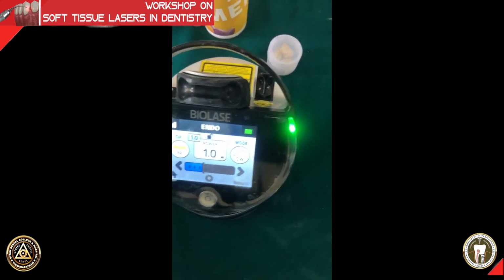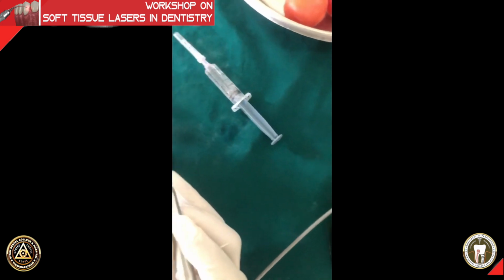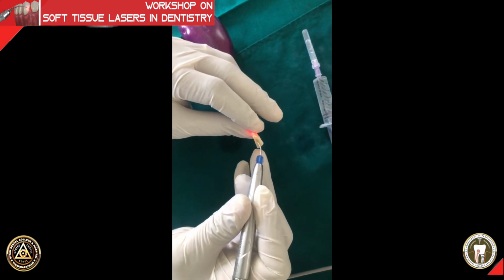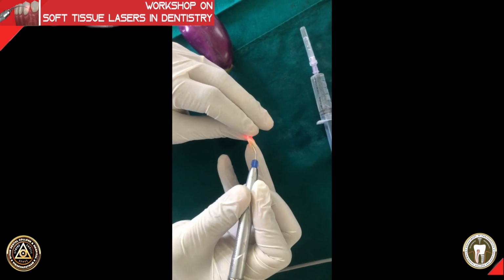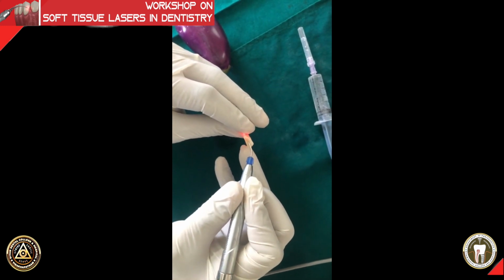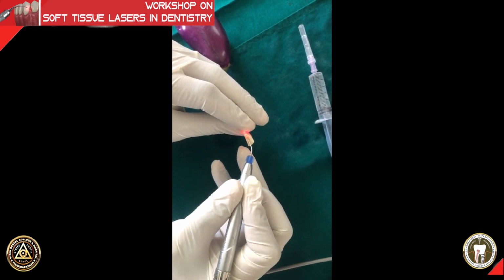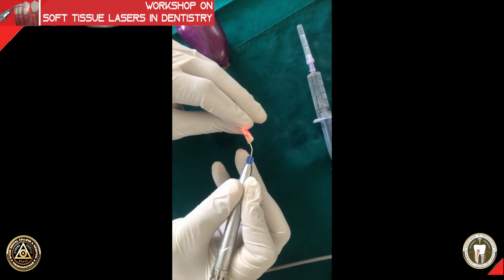For each canal, you should calculate the working length minus 1 millimeter, and then calculate the amount of time you will be spending inside the canal. For example, in this case it is a 10 mm canal, so 9 mm we are going to start. So 9 into 2, because every 2 seconds you come out 1 millimeter. So it is 18 seconds spent in the root canal. You cannot spend more, you cannot spend less. You have to finish that and make sure you do a circular motion. No need to touch the walls of the canal.